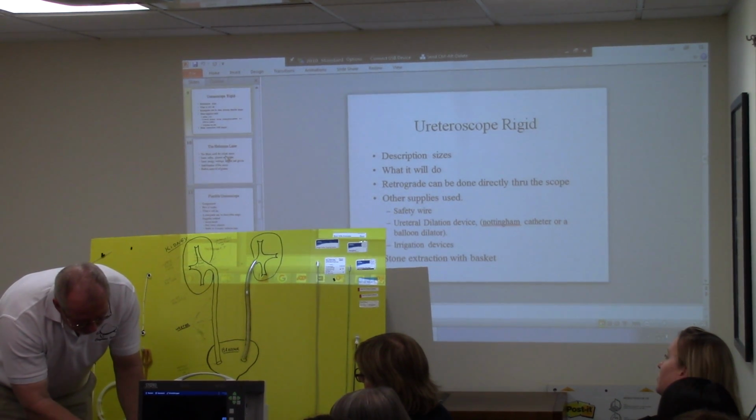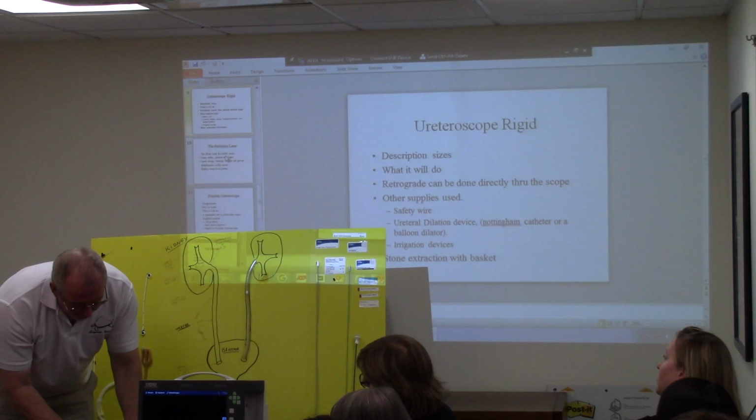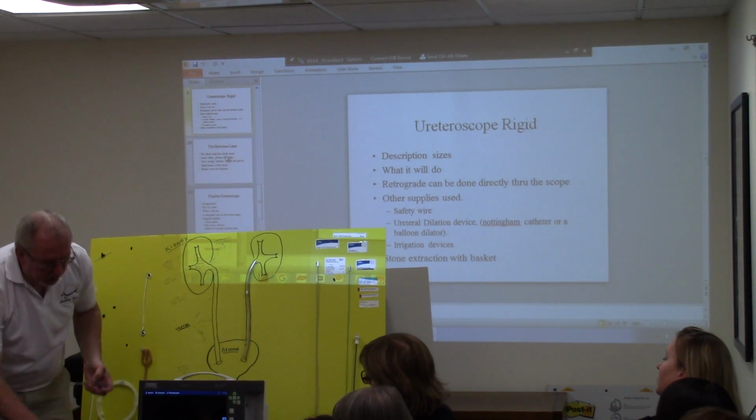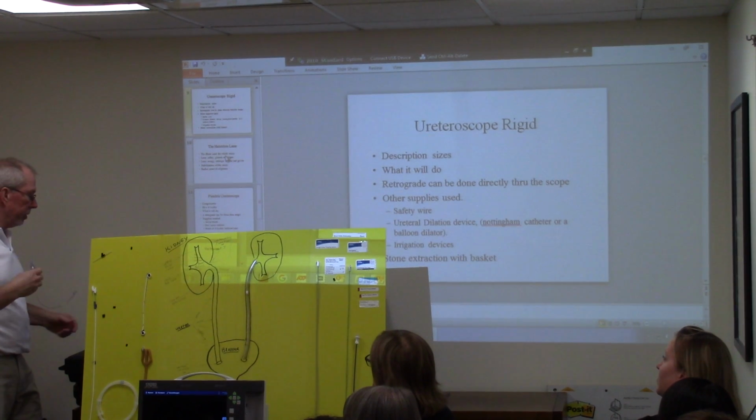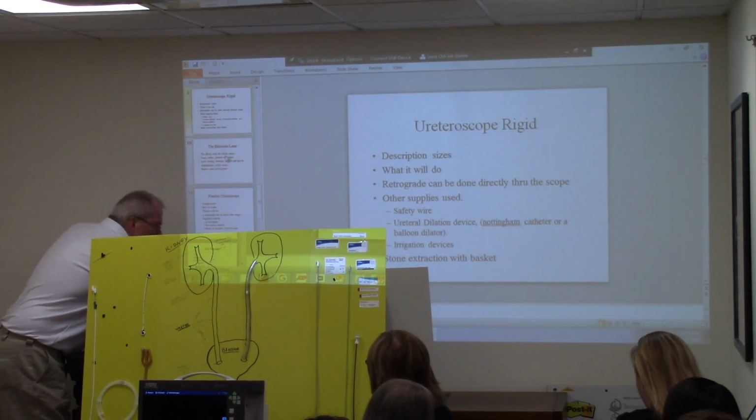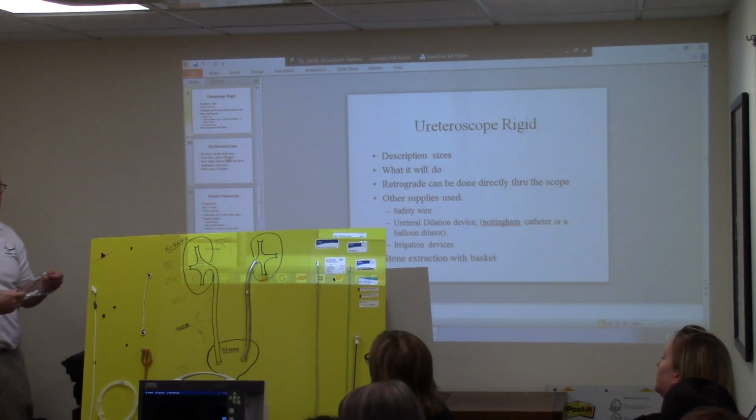Through the scope, he'll just continue whenever he needs it, adding a little bit of water pressure so you can see. Is that something new that you guys are using more now, this pumping system? I'm seeing it a lot more lately than before.